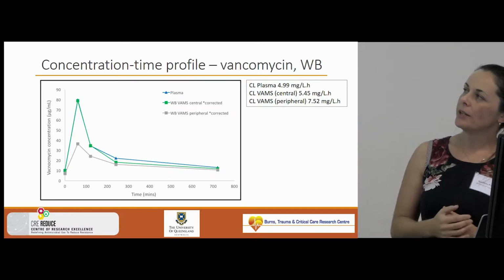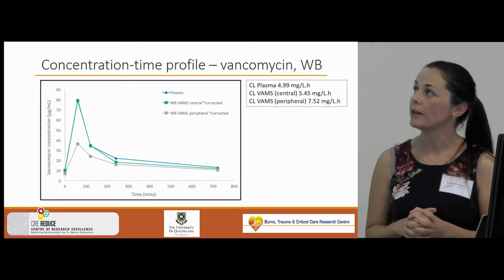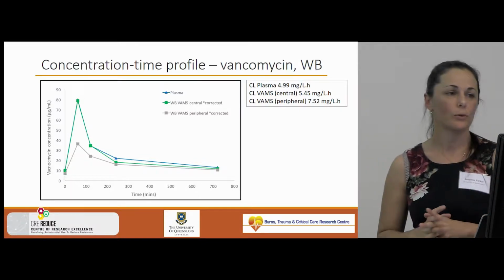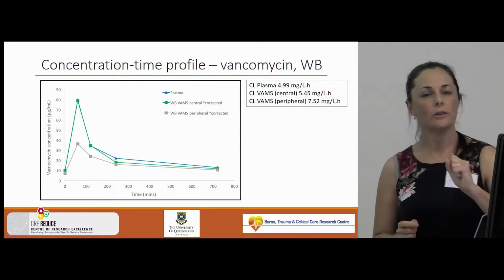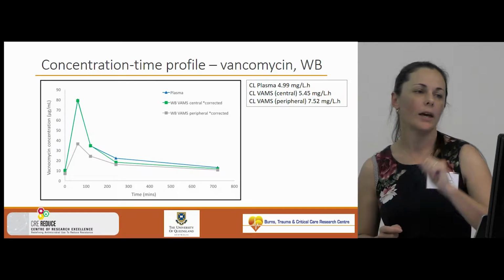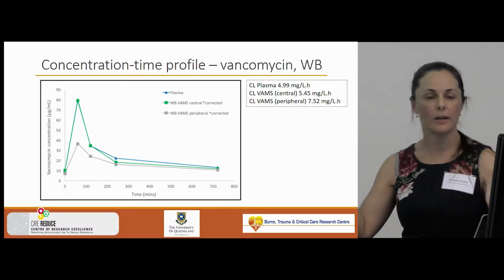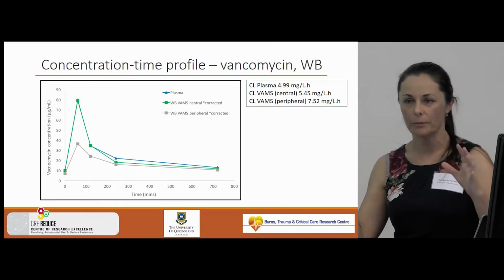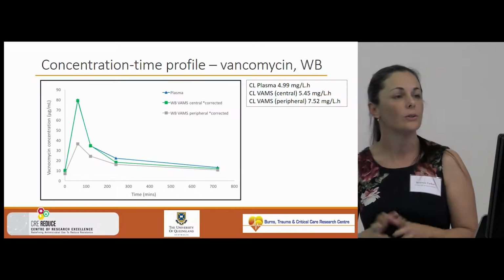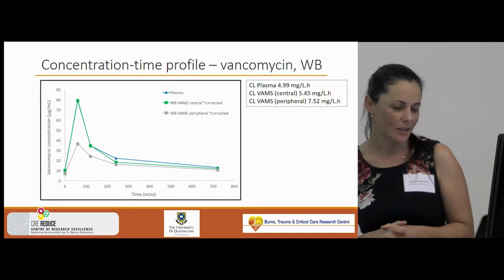The FDA recommend, not specifically for microsampling, but for our studies, a test called an incurred sample reanalysis. We perform this in all of our clinical studies. It's where you take 7% of your samples, you reassay them, and you compare the original result to the reassay result, and you look at the deviation to the mean, and if it's within 20% for a small molecule or 30% for a large molecule, it's acceptable. This data did meet that acceptance criteria.